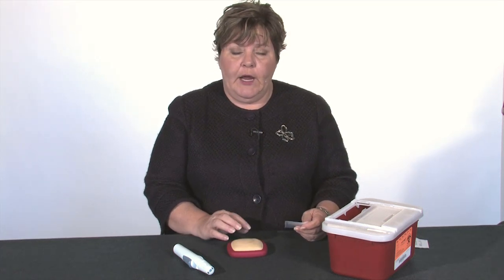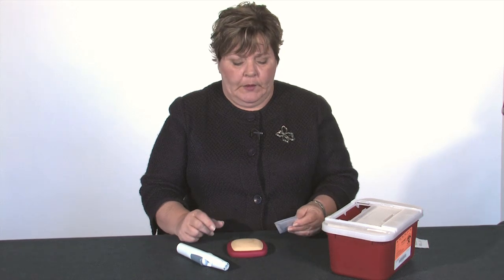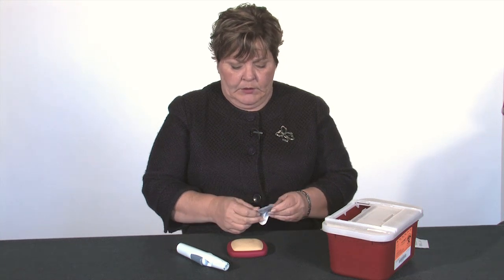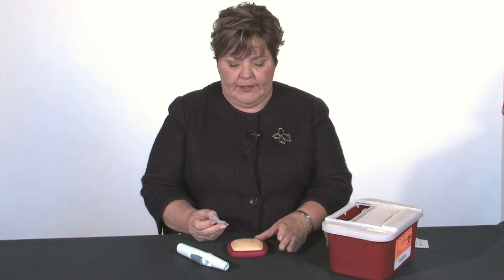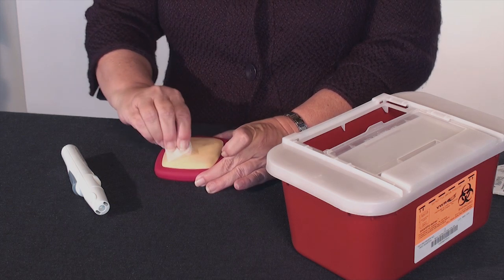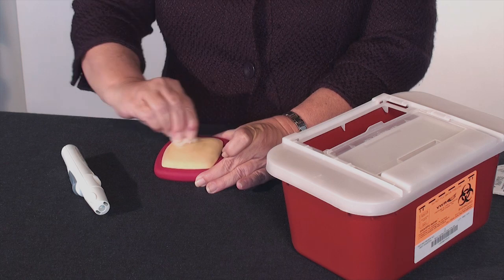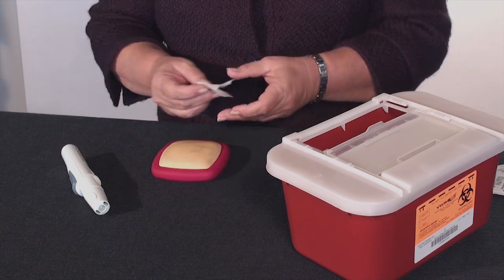First you're going to prepare your skin. The areas to inject are going to be areas where you have a layer of fat. This is a subcutaneous injection, which means it's going into the layer between skin and muscle where the fat stores lie. So generally that's the stomach or the outside of the thigh. Determine what area you want to inject and then vigorously clean that area with an alcohol wipe for about 20 seconds. Let that dry.